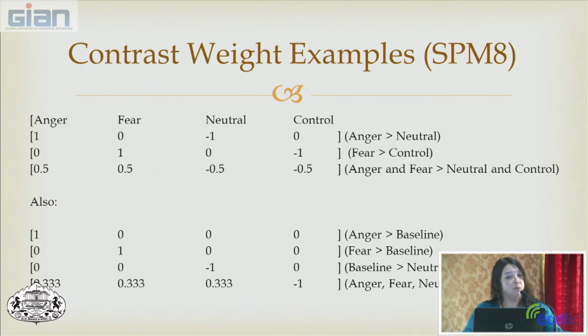But sometimes for event-related tasks, instead of assigning a rest, they're doing the event, you remember they do single events in event-related. The signal we're assuming is rising and falling. And then the space between that time and the next stimulus is what we would call baseline. So we don't always model this time, and we could just tell SPM to take all the timings that aren't modeled and call this baseline. In this case, our contrast weights would add to 1.